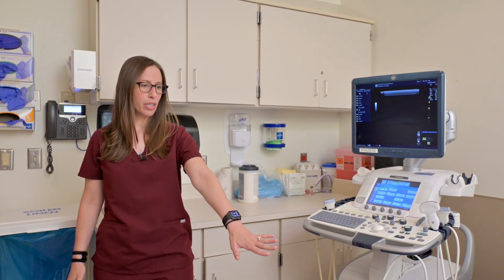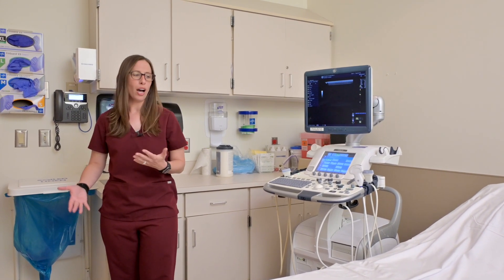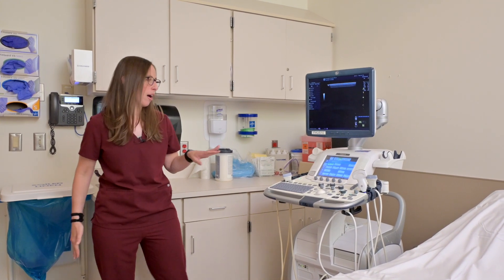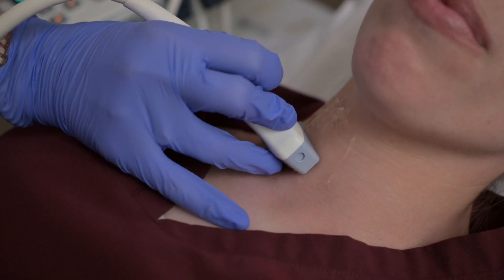I have Amanda here, one of our technologists in the ultrasound department, to go over what you can expect as a patient coming in for an ultrasound scan. Typically, patients check in at the front desk, go to the waiting room, and then a technologist will bring them back to the room. They'll lie down on the bed, and we'll need access to the area we're scanning — either lifting a shirt for abdominal scans or removing pants for leg vein scans. We cover the patient as much as possible to maintain modesty. We use the probes with gel applied, scanning over the area, which produces an image on the screen.